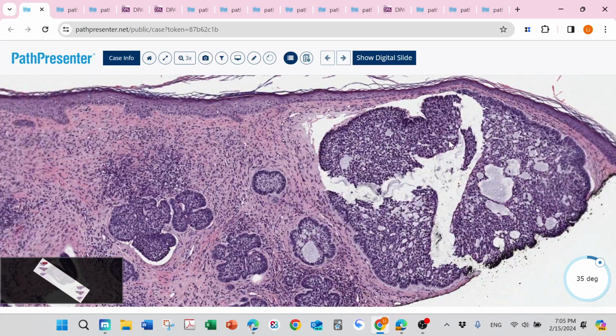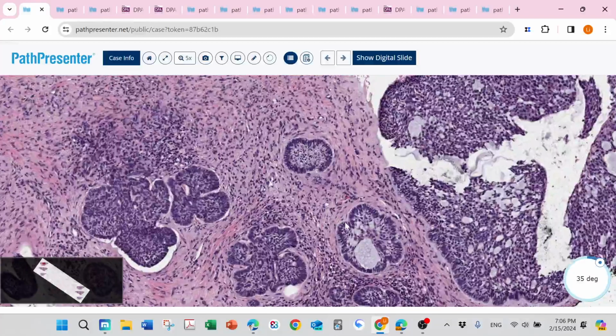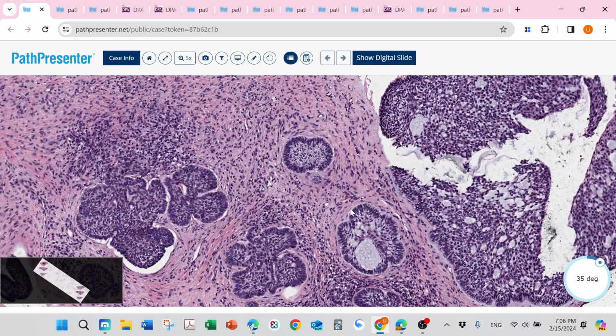this nodule has a separation from the stroma. And then the stroma looks kind of bluish. That is the classic basal cell carcinoma stroma, bluish like mucinous material. This bluish mucinous material may be around the nodule or even inside the carcinoma.